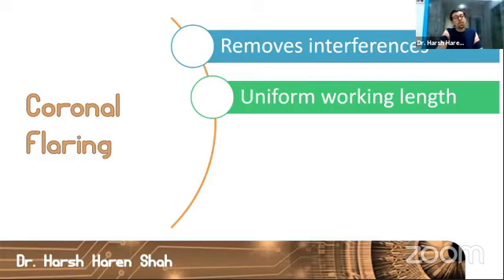What would happen is, when you would actually do orifice modification or coronal flaring, you would cause straightening of the root canal. This straightening of the root canal will cause shortening of the working length, and thus your working length will change. So it's important that working length is always estimated after the coronal 1/3 of the root canal has been prepared.